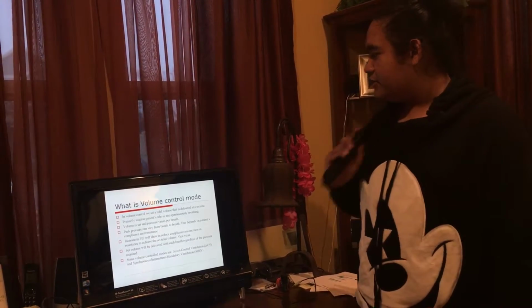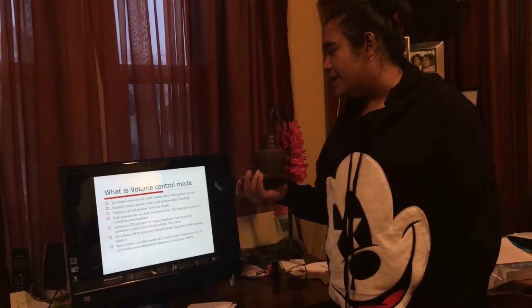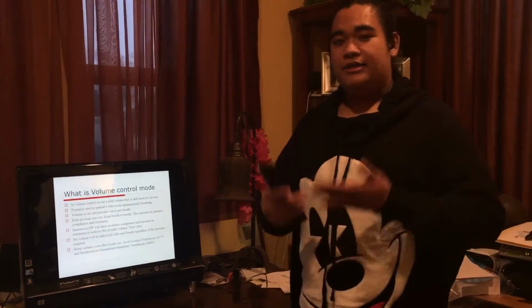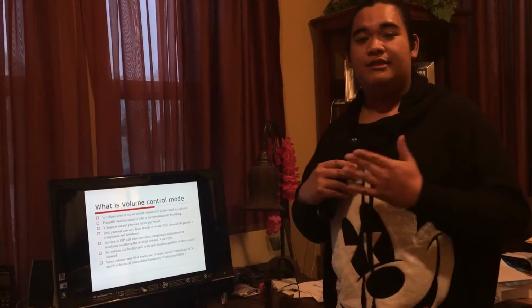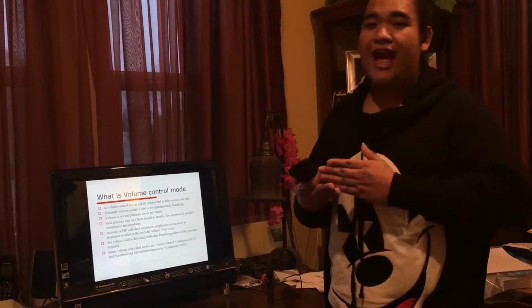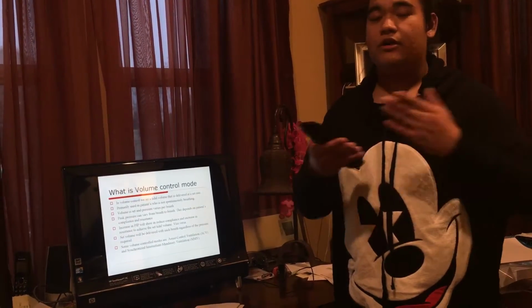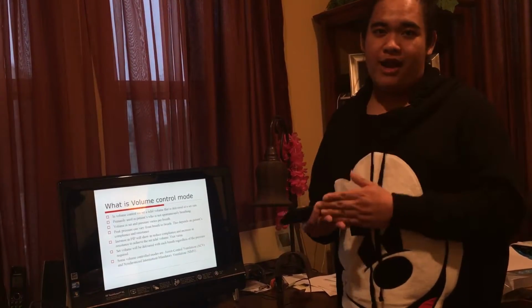So what is volume control? Let's start there. It says here on our PowerPoint that in volume control, we set a tidal volume that is delivered at a set rate. That is true because in volume control, we set a tidal volume and the pressure given to the patient will vary depending on the patient's need, but the volume is set. Whatever happens to the patient's breathing or the lung mechanics, the volume is going to be the same every breath.